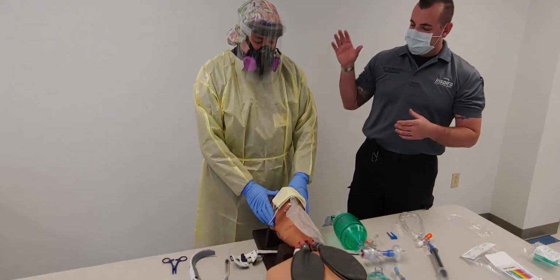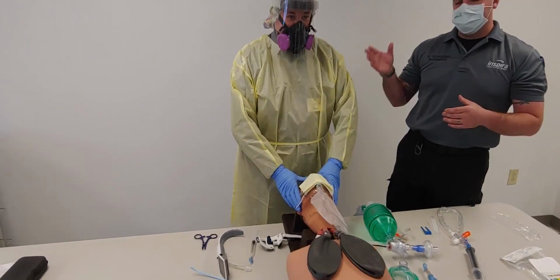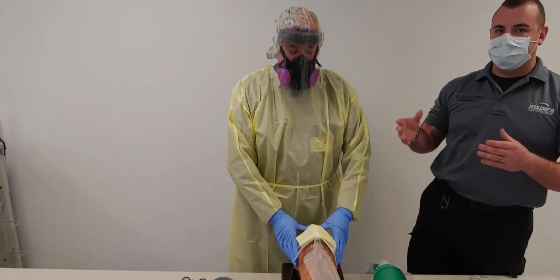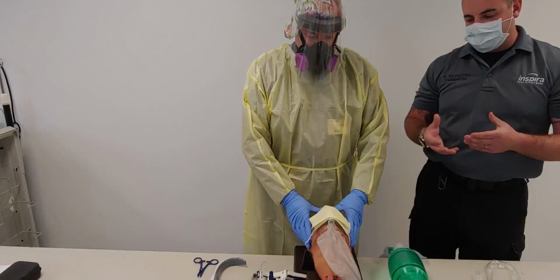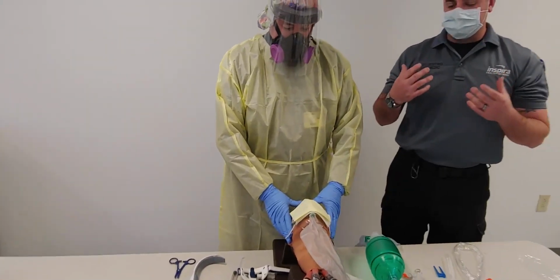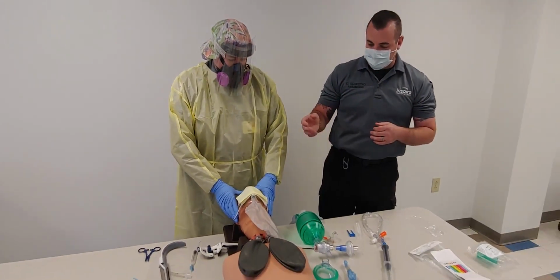For all of the procedures, Brian is in appropriate PPE. This video doesn't go into donning or doffing or what the appropriate PPE is. This is mainly just the airway management aspect of it. Myself, for this video, I just have the mask because I'm just going to be orating for you.